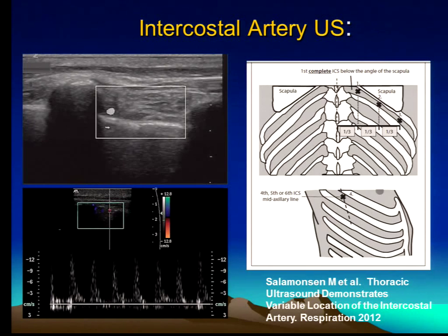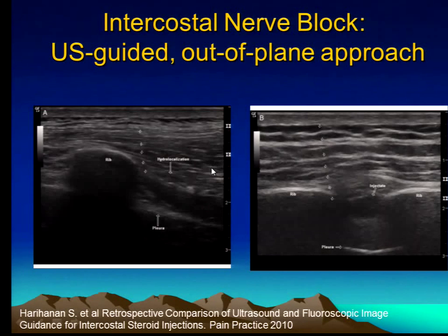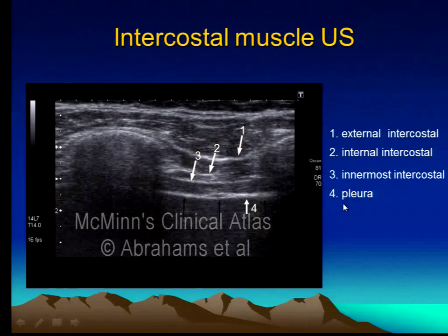If you look at this picture, you'll notice that you can see a vessel here, which corresponds to roughly the various locations you can identify. If you want, you can also put a color Doppler on — this tells you it's obviously a vascular structure, and you can see the pleura underneath it. Here's a picture of the muscles and the pleura — here's a rib and we're in the transverse plane. This picture shows you the three distinct layers, and of course the pleura is down here, so you would expect to see the vessel approximately here.